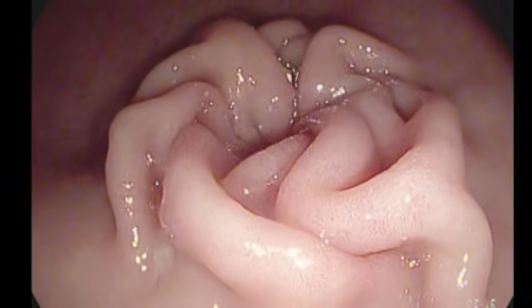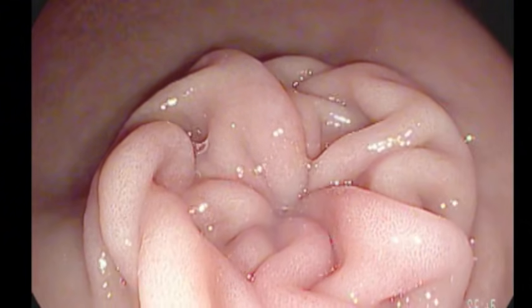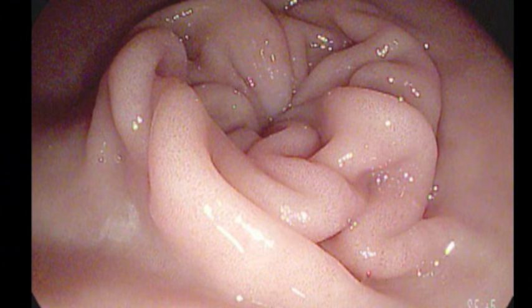During this peristaltic contraction of the pyloric region, the gastric pits can be distinguished. This is known as the pit pattern, which will also be seen in the colon.